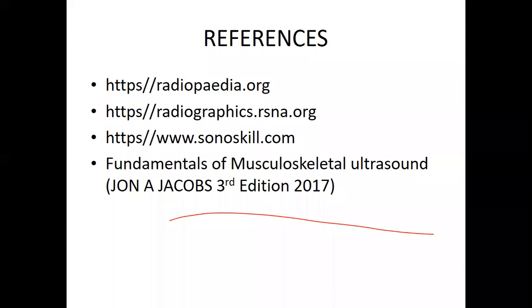I didn't get anything. And then for the tendinopathy and fluid collection, I think the key message here is that you have to be familiar with the normal bursa, how it should appear. A normal bursa on any MSK is not visible. Even when we deal with the knee, it's not visible. But once you see it appearing, then something is wrong there. So the key answer is you have to be familiar with the normal.